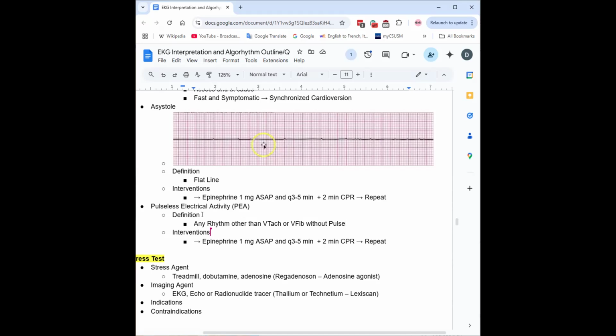So always check your patients too. Always assess your patients. Do you have enough information to determine if this patient is actually safe? Or are they just silently dead, but electrical activity is still happening?